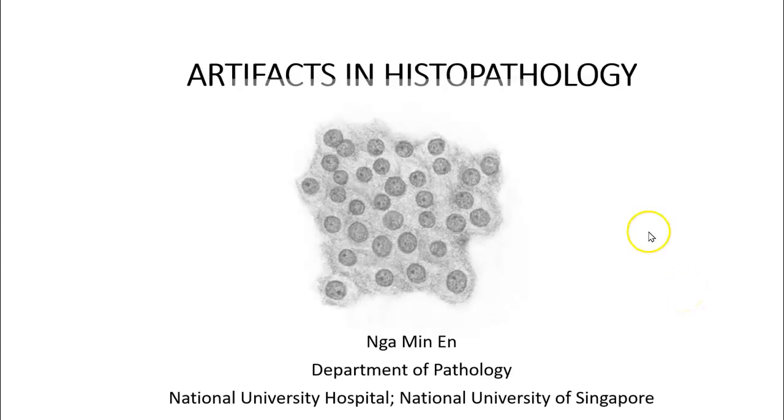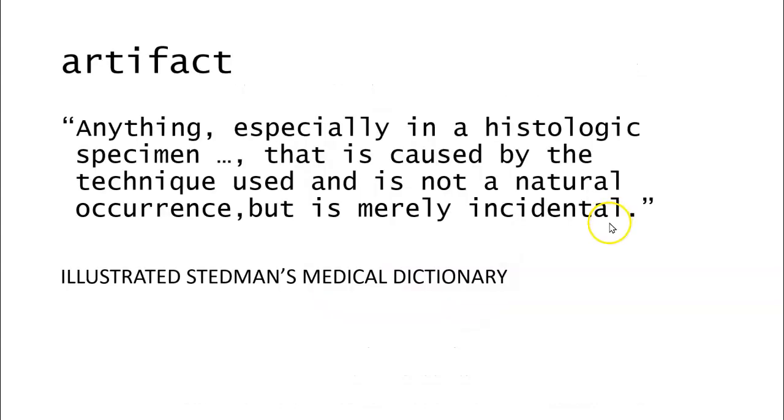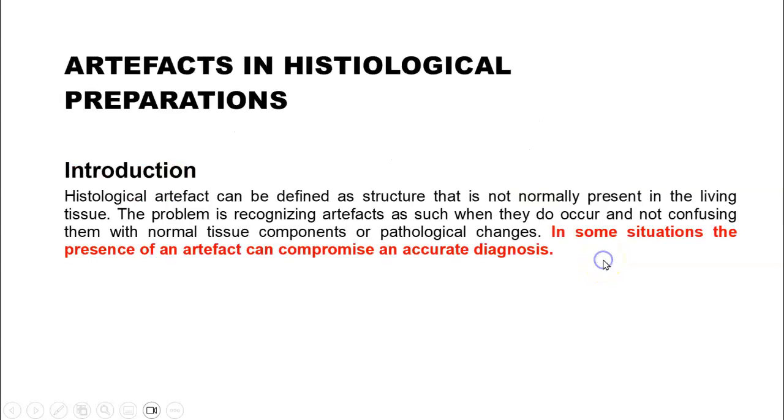Hello. In this talk, we are going to look at artifacts that you may encounter in histopathology as well as cytopathology. So let's first define artifact, and this is anything, especially in a histologic specimen, that is caused by the technique used. It's not a natural occurrence and it is incidental.